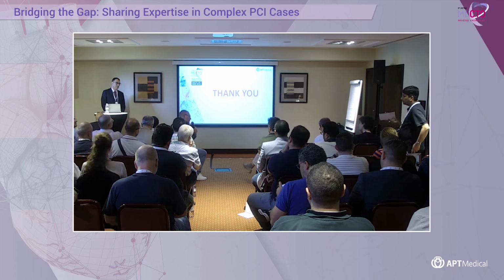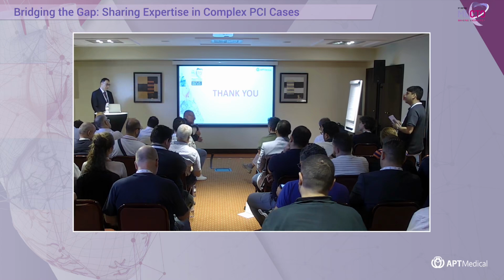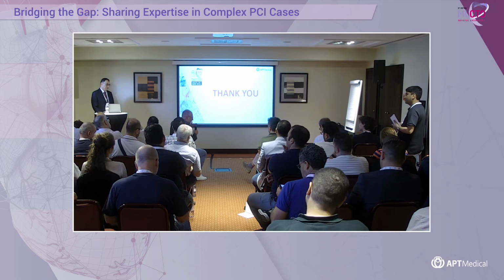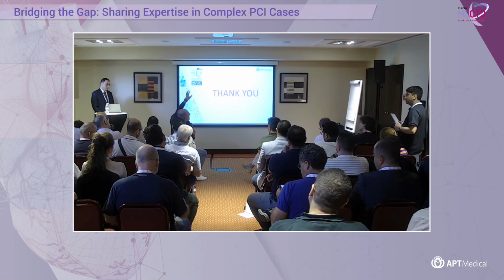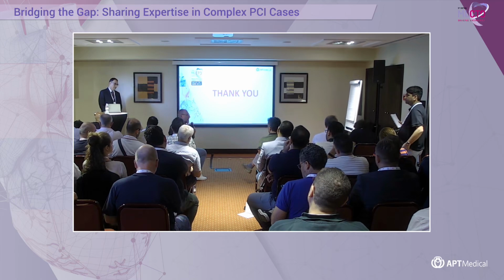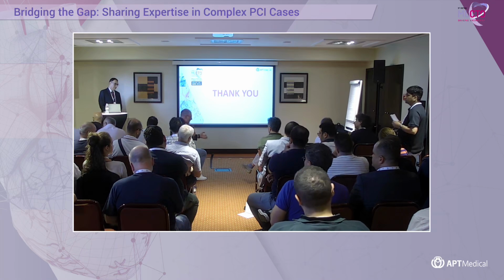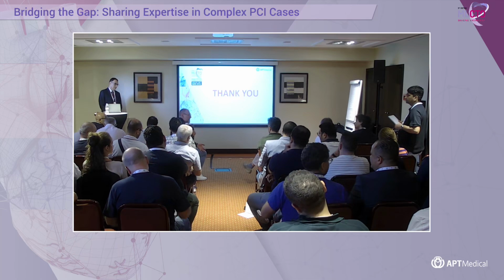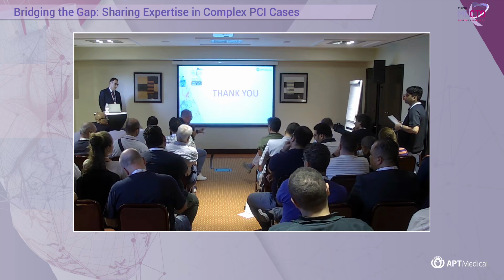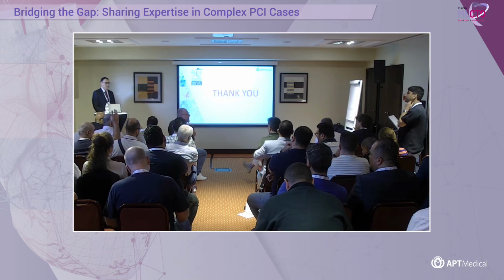Yeah, but don't forget that the flow is going also antegradely from the LIMA to the LAD. So you have a competitive flow, but the flow is not going from the LAD up to the LIMA. So it's not right, because it's an arterial flow. I think the flow is going also from LIMA to LAD, and you have some backflow, but small backflow in 1-2 centimeters, but it's not going up.